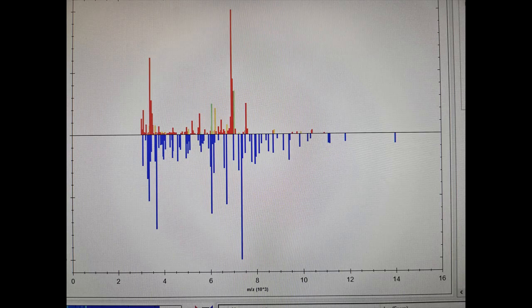And what is with all of the colors on this graph? On the bottom we see the tested organism, which is highlighted in a solid blue. And on the top we see one of the library organisms used by the MALDI. We can see three different colors, red, yellow, and green. Sounds familiar, doesn't it? The red particles don't match up too well with the blue particles on this graph. The yellow, kind of, and the green does. So we can see that good matches show up green like they do with the dots on testing. We can see that yellow matches up somewhat like they do on testing, and red doesn't match up like we would see on a bad matchup in testing.